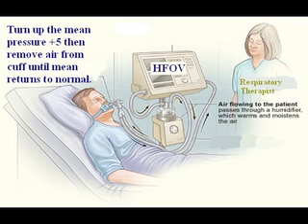Also worth mentioning is it's important to have a cuff leak. Turn the mean pressure up by 5, then remove air from the cuff until not only do you hear a cuff leak, but the mean pressure returns to where it was prior to that.